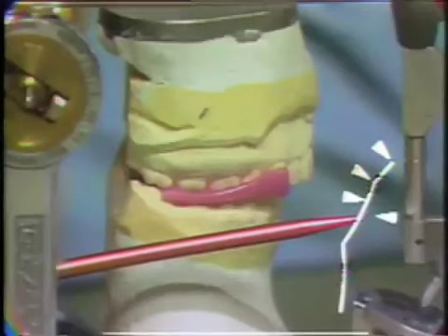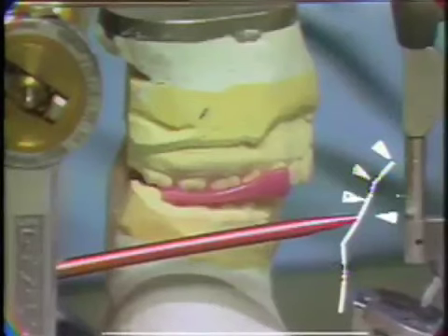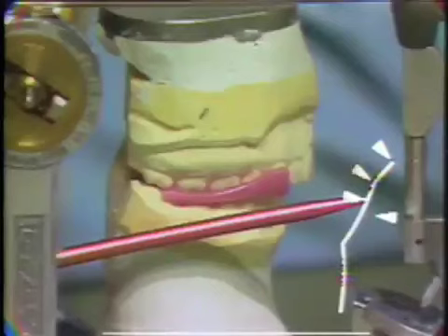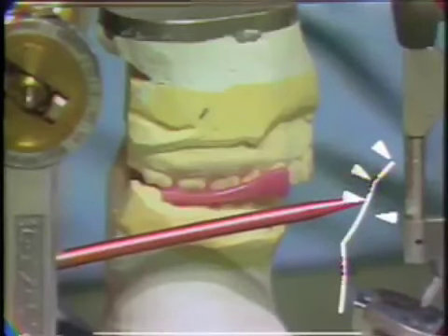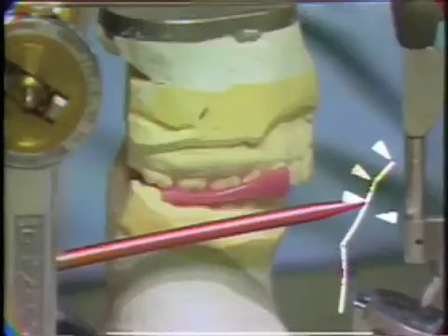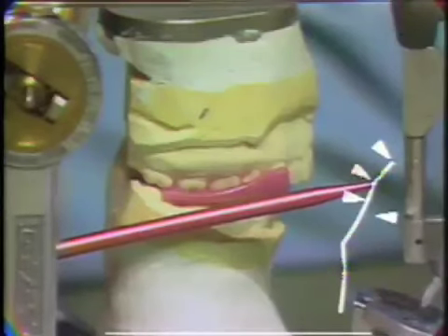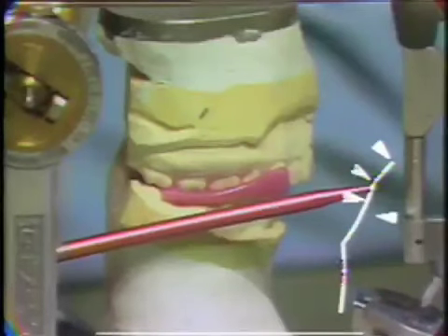If we refer back to our drawing again, this is our terminal hinge movement. We have recorded our centric relation registration at a higher level, or an open position, with the teeth apart along this closure. And we would hope that we can take the centric registration from between the teeth and have the teeth close into contact, into centric relation, the same on the articulator as they would do in the mouth.